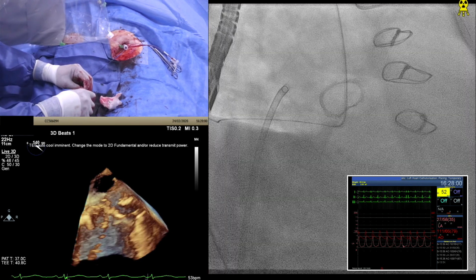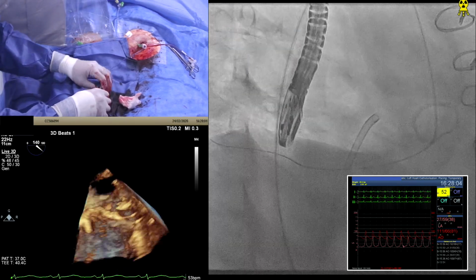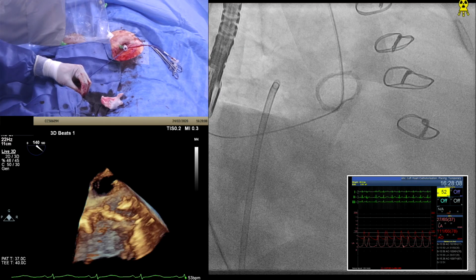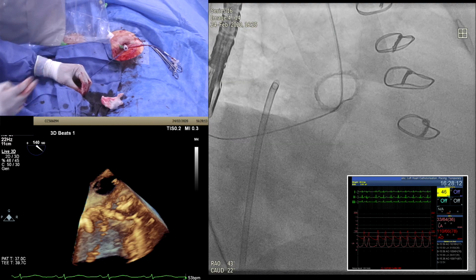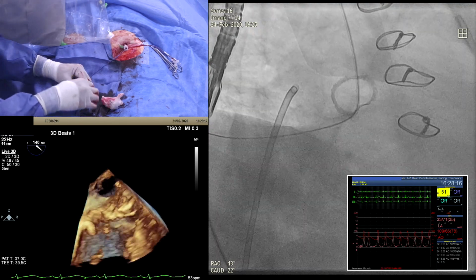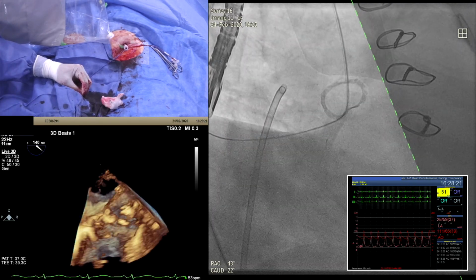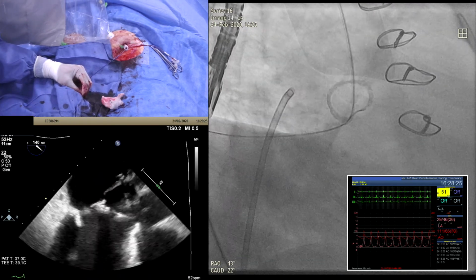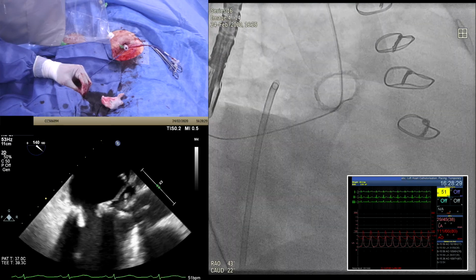Okay, good. So we're going to rotate that up into the atrium. So come back a bit. Sorry, come back a bit. Okay, I'm just going to take a cine of that. Okay, so we're definitely not through the mitral valve. Okay, and now, Bushra, take your time with taking some pictures of this. Well, I caught you going through it. Fantastic. So it really is just getting the eye in on where the hole is and then throwing a dart at it. So that's exactly what we did.